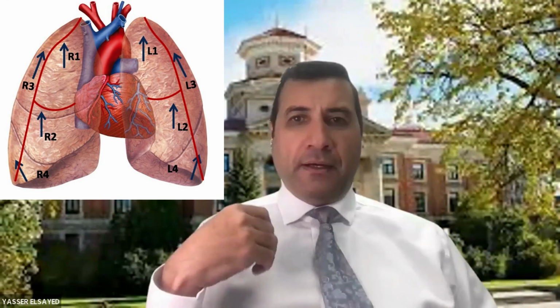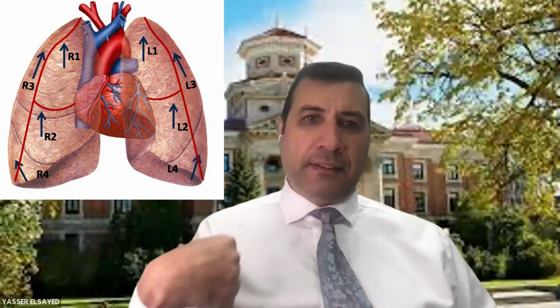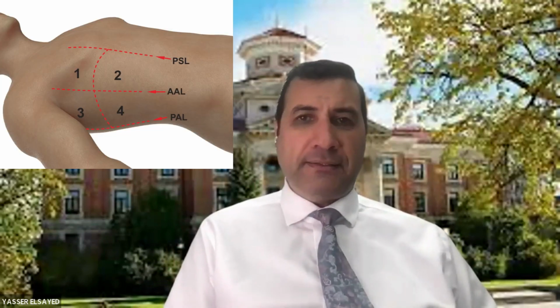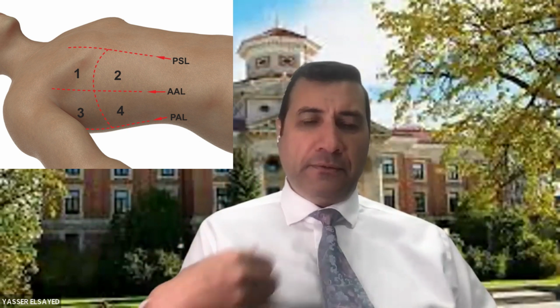In neonates, we scan 4 zones on each side: upper, lower, anterior, lateral, and then costophrenic angle on each side. We have 4 zones on each side. In adults, we have also 4 zones to be assessed: anterior, upper and lower, lateral, upper and lower on each side. We have 4 main patterns of lung ultrasound.